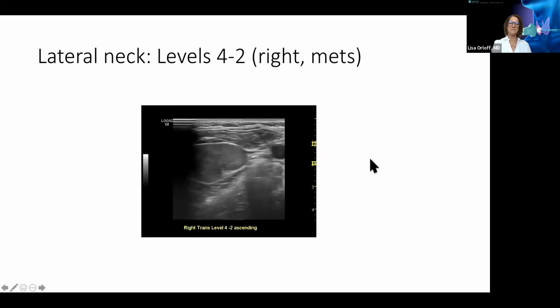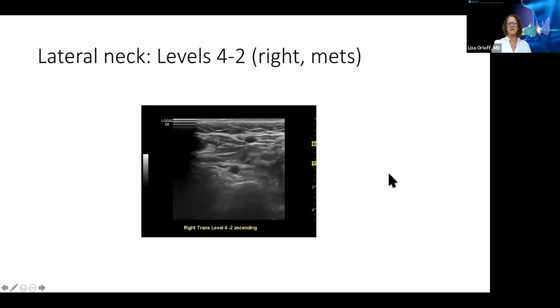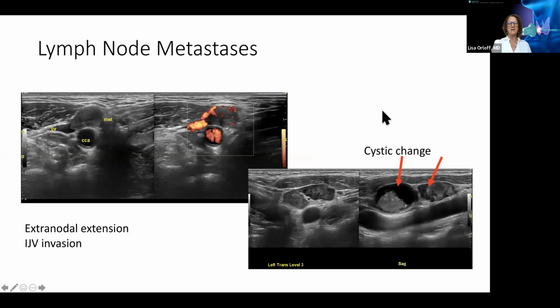And these are not to be missed in the patient who might have a microcarcinoma or a subtle camouflaged nodule in the thyroid in a gland that might have a dominant nodule that you're considering for radiofrequency ablation, but you don't want to ignore the rest of the thyroid and the surrounding structures.